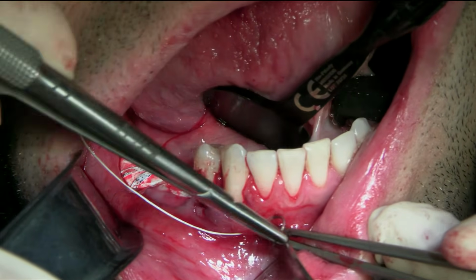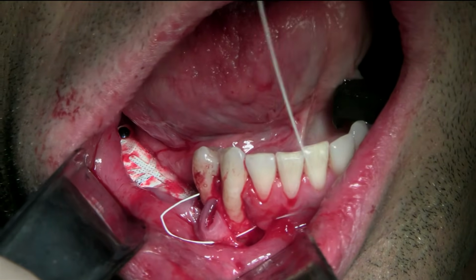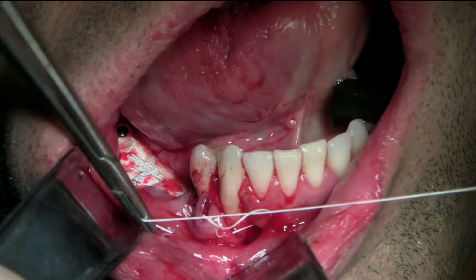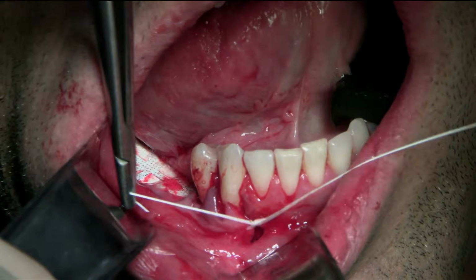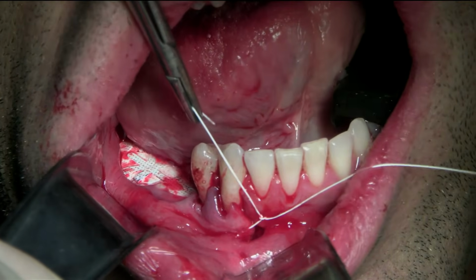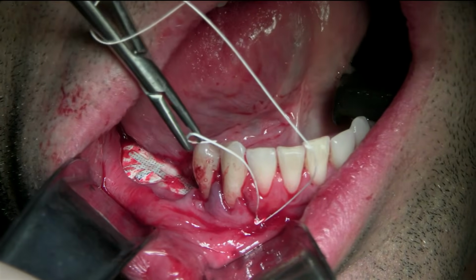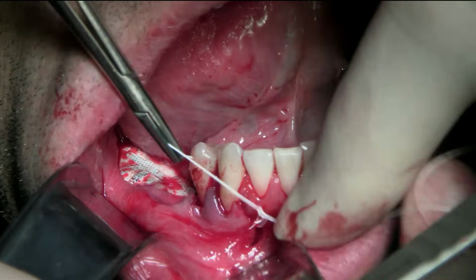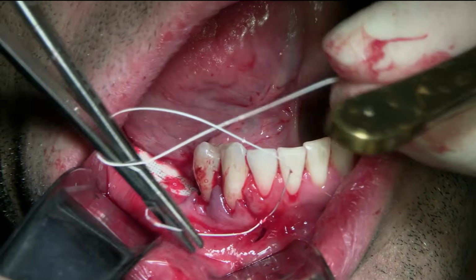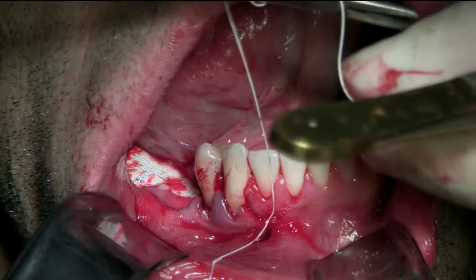Because sometimes in these big flaps, especially with vertical incisions, you lose the correct position. My knots are 2 knots first, or 2 throws. Then 1. Then 1. And then 2.